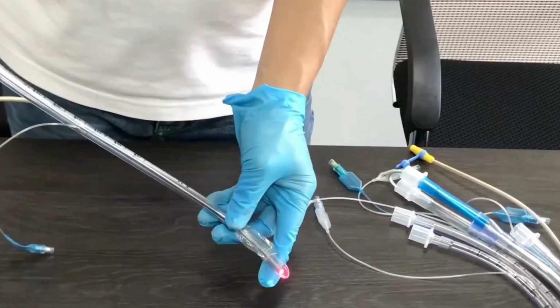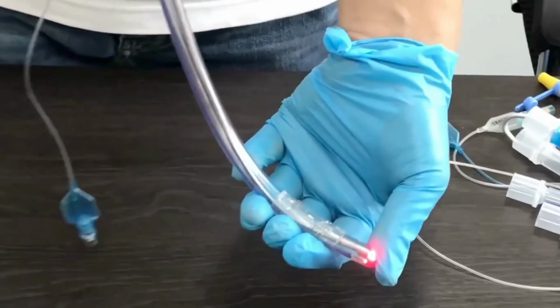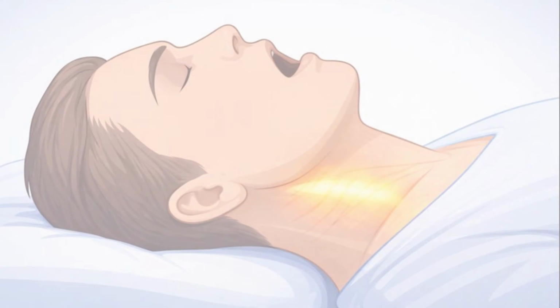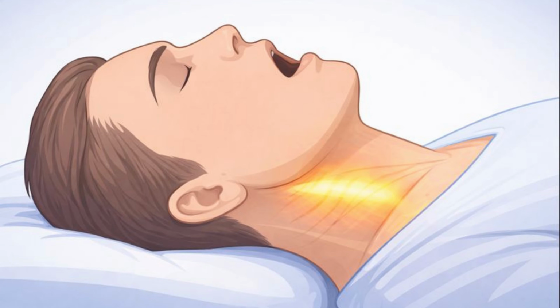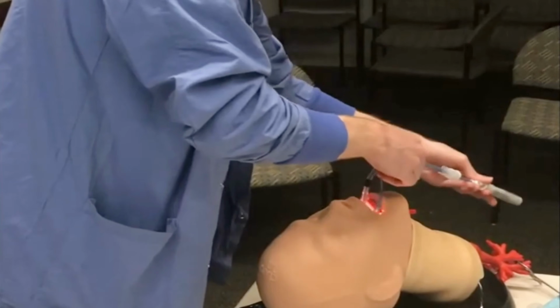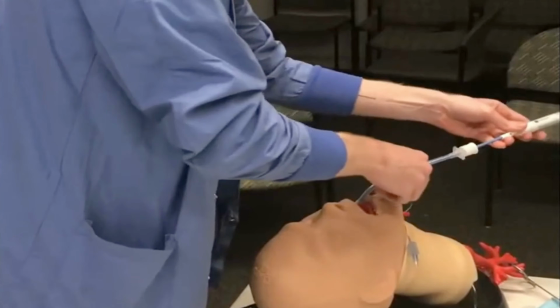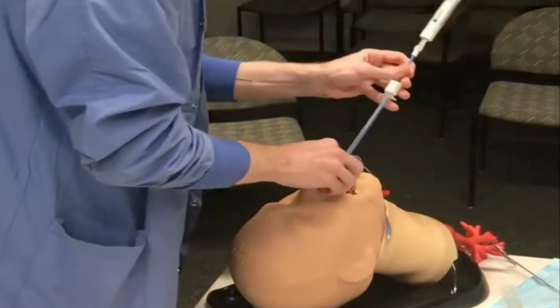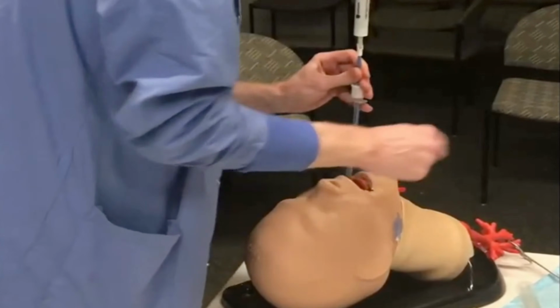Reduce ambient lighting if possible. This makes transillumination easier to interpret. Position the patient with the head in a neutral or slightly extended position. Open the mouth and insert the tube in the midline, following the contour of the tongue. Advance slowly and deliberately. Do not force the tube.